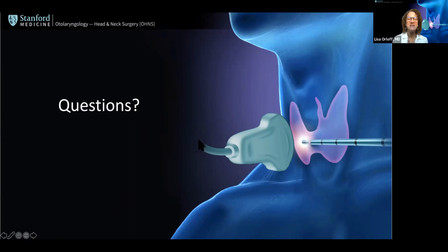So I think somebody asked about RFA, Dr. George, hi there, about RFA for parathyroid adenomas. Dr. Rangel answered this in the chat, but I just wanted to add to that, there's been very little published data on this. The number of cases is very small. As Dr. Rangel mentioned, this is a very low morbidity, low risk surgical procedure for the specifically well-localized, accessible parathyroid adenomas. So the very same nodule or a parathyroid that's going to be easy to do an RFA on is going to be very easy to remove surgically.